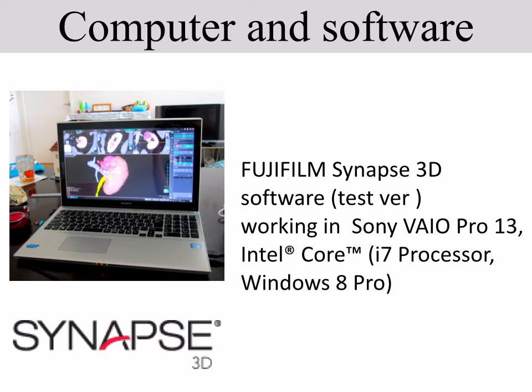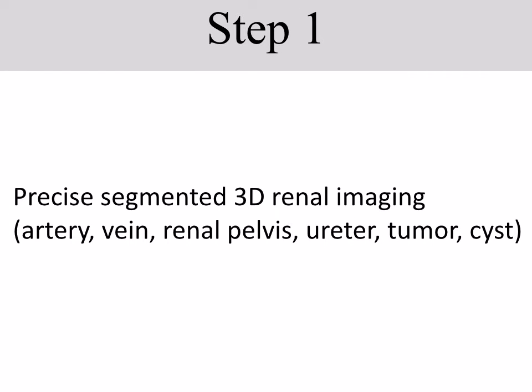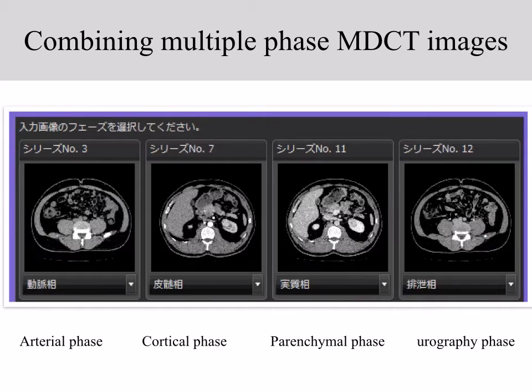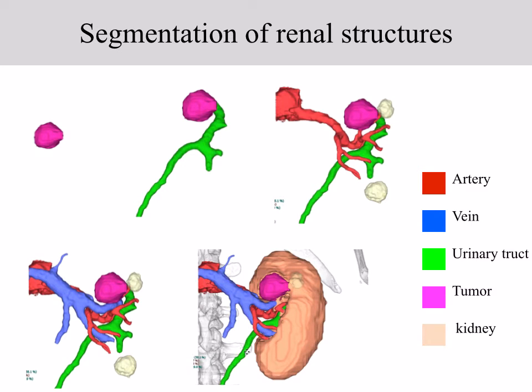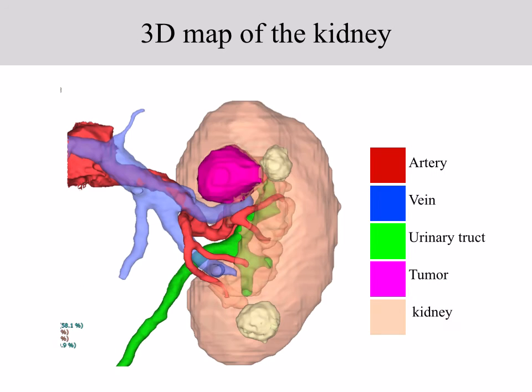We performed the Virtual PN Analysis with Fujifilm Synapse 3D software working on a Sony laptop computer. Usually it takes about an hour to determine the final operation planning. In the first step, we made a precise segmented 3D renal image. We extract the renal anatomical structures from multiple phase CT images to combine them into one renal image. This imaging process is called segmentation. For example, using the arterial phase, renal artery segmentation is performed. Similarly, we segmented the renal vein, collecting system, tumor, and cyst. These segmented 3D images were then combined together into one 3D image, giving us a precise 3D renal map to plan the operation.